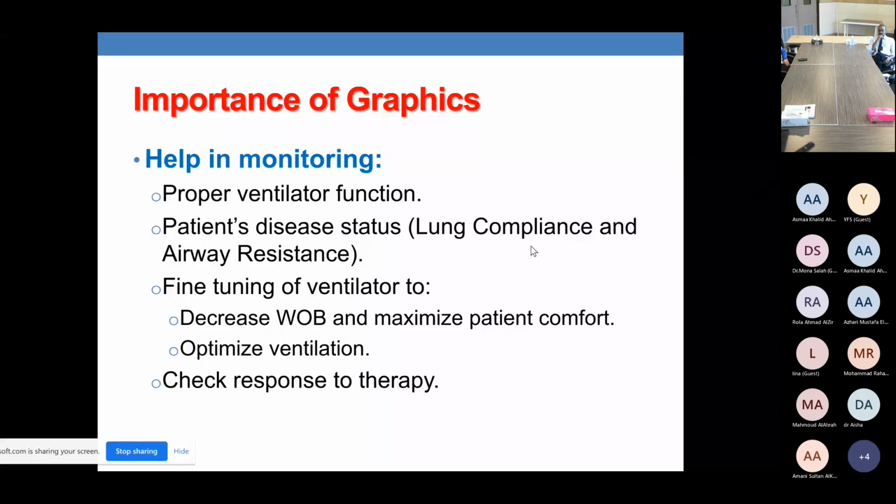And the airway resistance, as we said, is the neck of the balloon. If it is a wide neck, it is very easy to inflate. If it is a very narrow neck, it has very high resistance, so you also need high pressure to generate flow. So this is the best way of explaining that. In the NICU, you have airway obstruction, which usually happens with meconium aspiration syndrome due to a lot of secretions and, of course, meconium obstructing the airway.